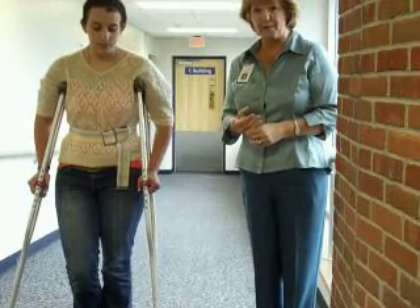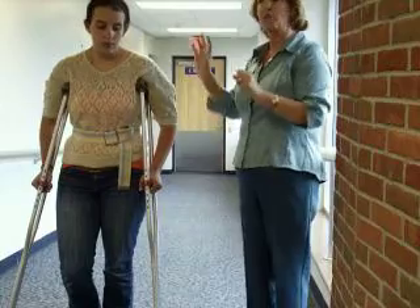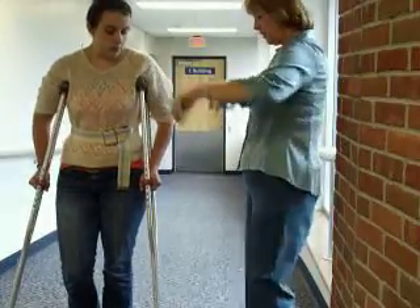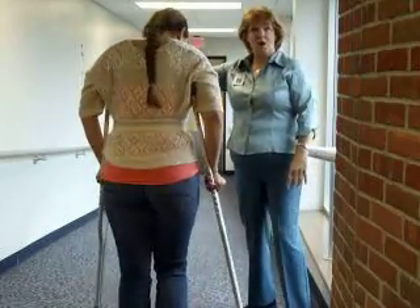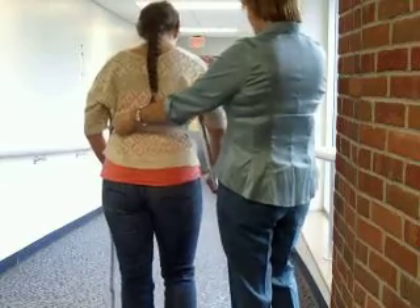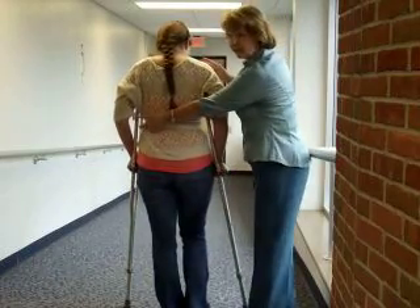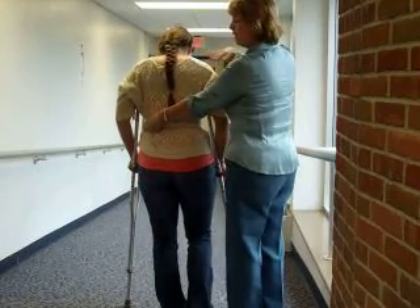So if I were going to be teaching this patient, we're going to start off with her being non-weight-bearing on the right. We would have gotten her up out of her wheelchair and I would have demonstrated for her first — we're going to say we've already done all that. Now we're ready to actually do the walking down the ramp. The ramp starts approximately where this flat wall is. So we will walk up to the ramp first — do your normal walking pattern, crutches and step. So now we're at the top of the ramp. I have my hover hand in place; my other hand is on the gait belt on the far side. I'm behind her and to the involved side, just like I would be on level ground.